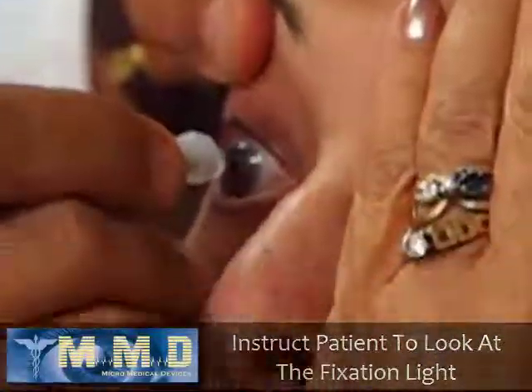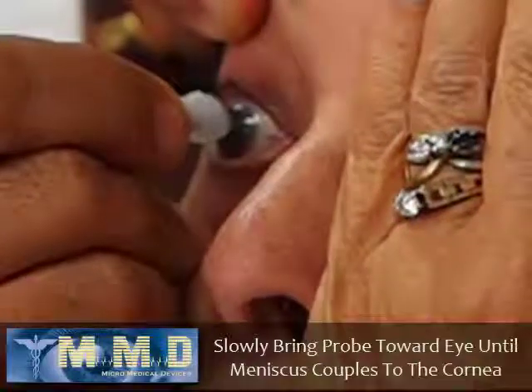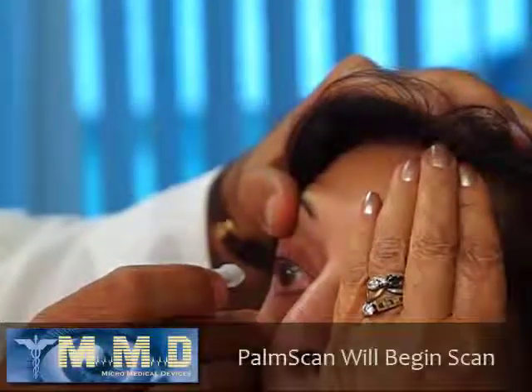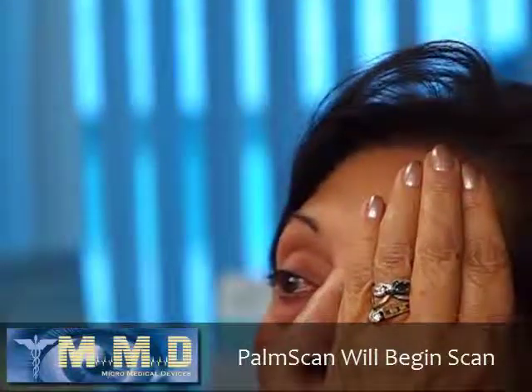And I gently just come forward until there is a connection between the meniscus and the eye, and the machine, as you heard, will do the scanning. Now that we have successfully scanned the right eye, we're going to scan the left eye.